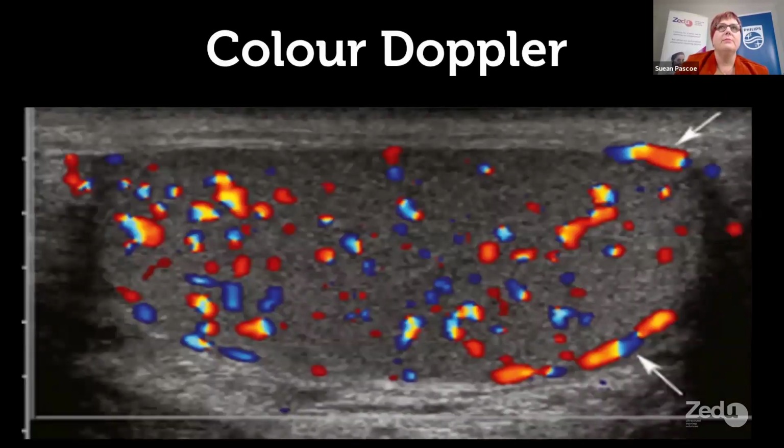You can see another example here, and it's a really fine line between having the gain set too high. I would say in this picture it is a little high because it's all aliasing here. So I'd wind the color gain down a little here so that it's proper, just red and blue.